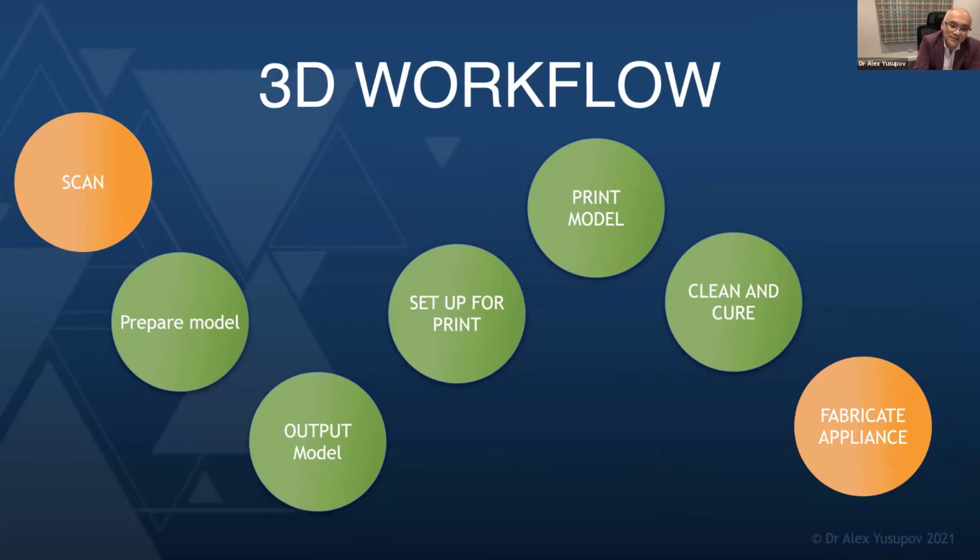3D technology, without being able to put something out into the real world, is really not useful. I mean, it's all very nice to see pictures, but if you can't do anything with them, if you can't print them, then to me, it really falls short. And it's only recently that we've been able to start printing stuff with consistency and reproducibility that I'm really excited about.